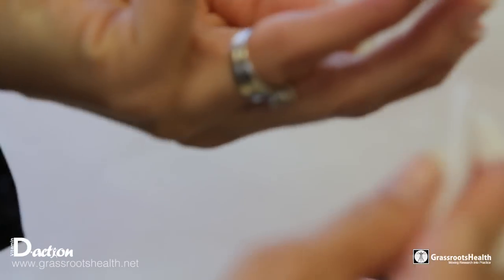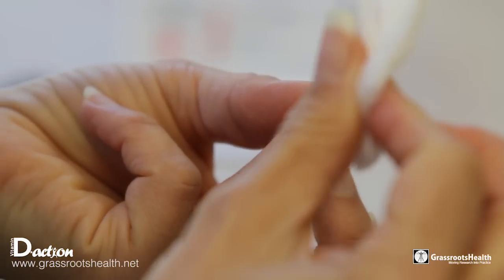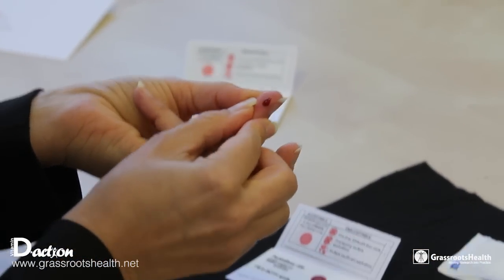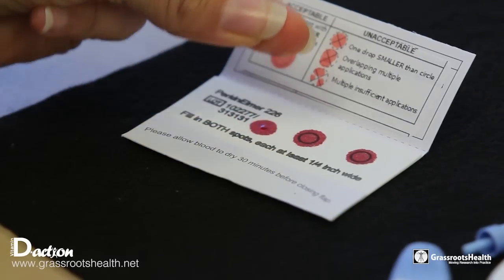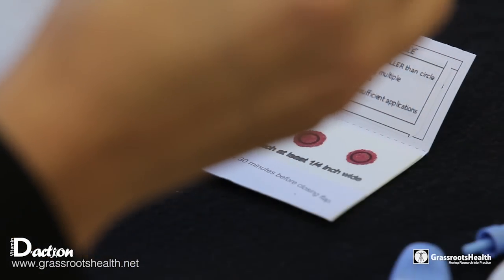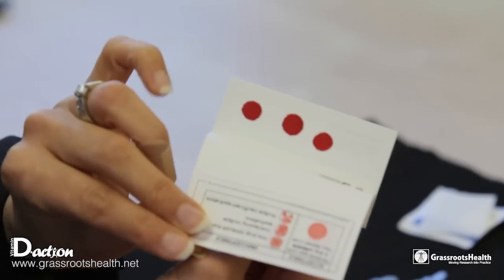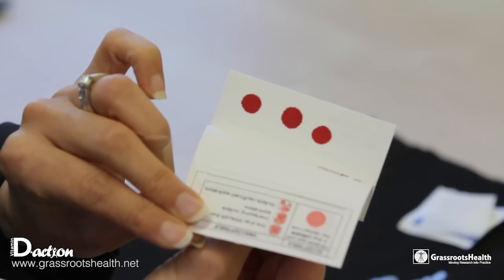If, for example, you do not get enough blood and you have put some in the drop itself, you can drop blood any place on that filter paper that is necessary. You could actually put another blood spot on there if you wish. Now that you have done this, take a quick look at the back side of the card inside to make sure that the blood has soaked through.